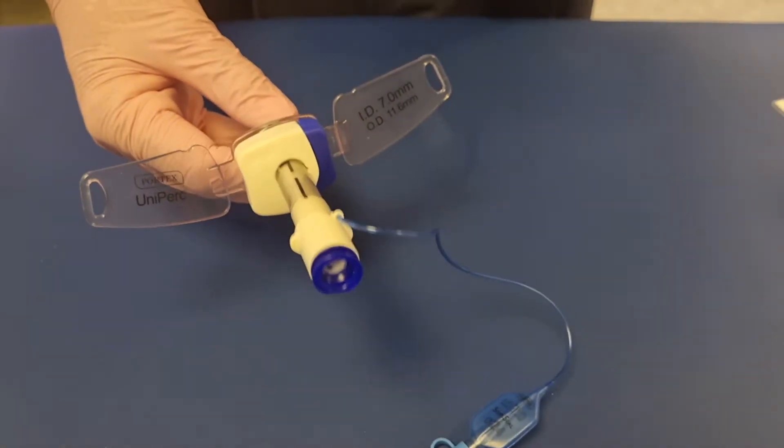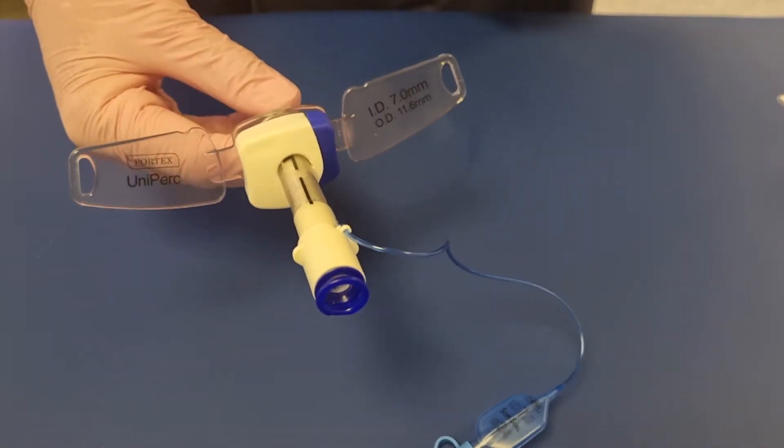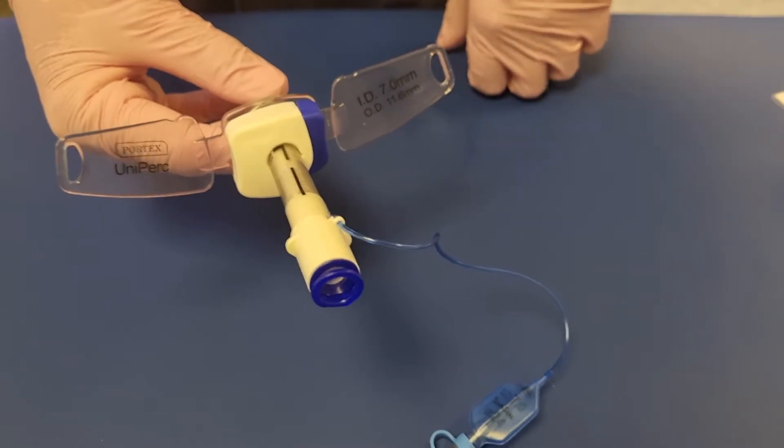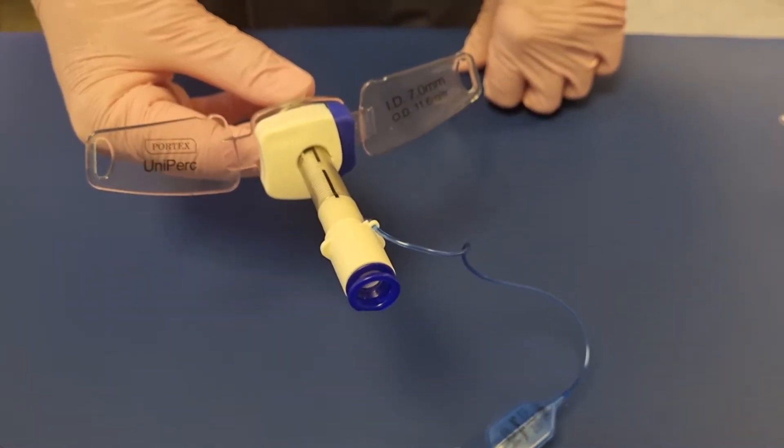This is an example of a PORTEX Uniperc tracheostomy tube. It's an adjustable flange tube which we use for patients who have a surgical tracheostomy.